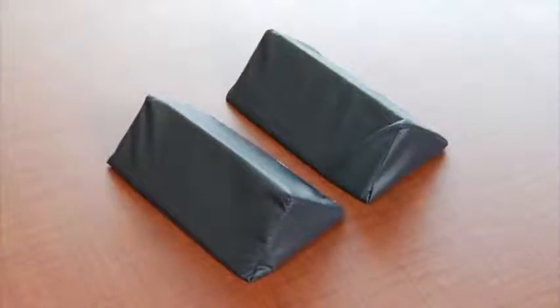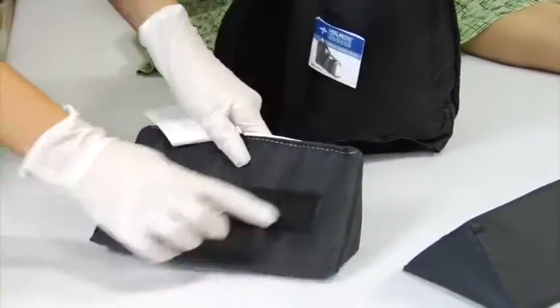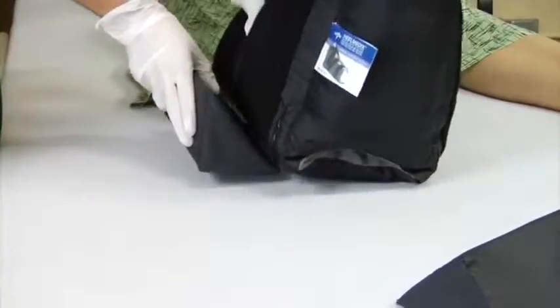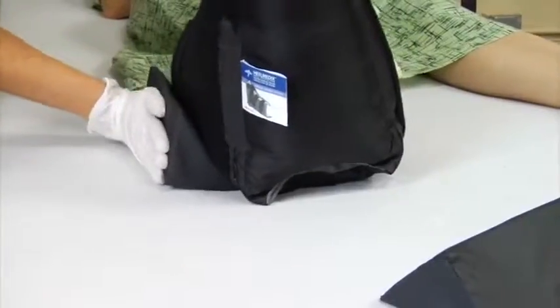To prevent lateral and medial foot rotation, an optional stabilizer wedge duo is available to use with the heelmedix. They come as a pair and are packaged separately from the heelmedix. Each of the stabilizer wedges attaches to the heelmedix with the same hook and loop fastener that the straps use. You can use one or both on your patient depending on what care they need. To apply the stabilizer wedge duo, start with the patient's foot upright, toes toward the ceiling.